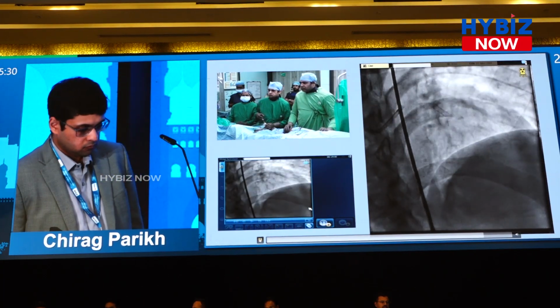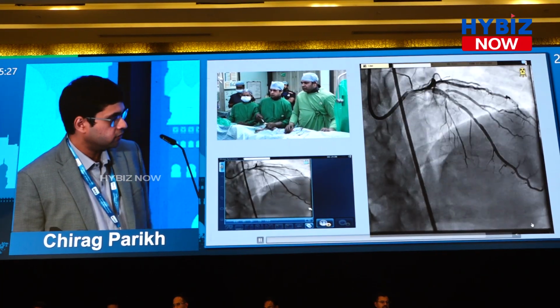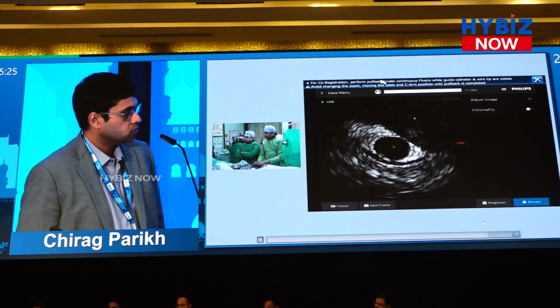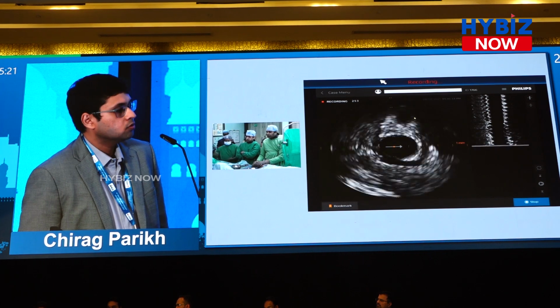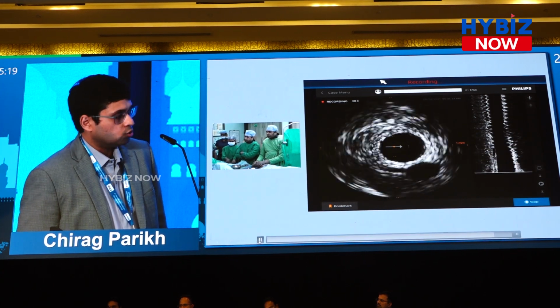Can I interrupt? Yeah, I think we can have a discussion. So if you have an ISR like this, what is your choice? If you have IVUS, which modality do you choose? So OCT. And why?